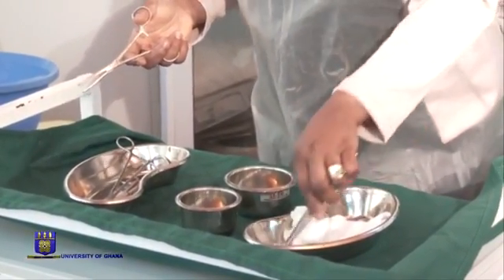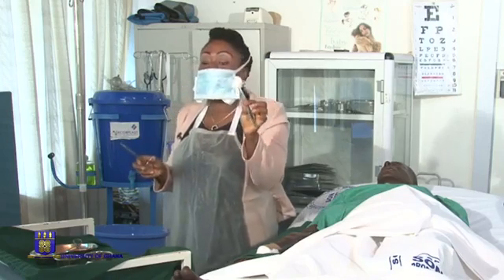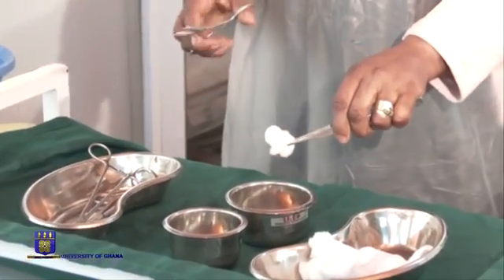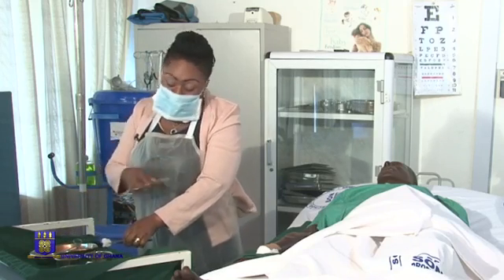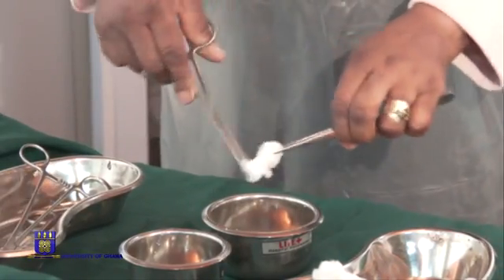So you pick your swabs. Please desist from putting all the swabs in the solution at once. You pick one swab, dip it in the solution for the dressing. If the wound is infected, then you squeeze into another receiver or gallipot. But for a clean wound, we can squeeze into the same gallipot.